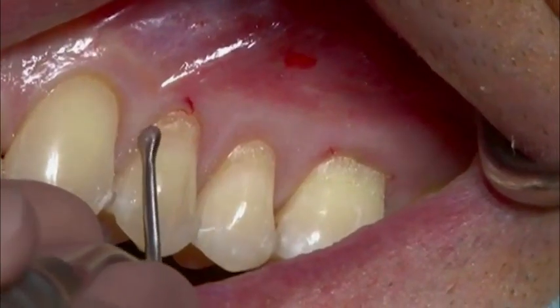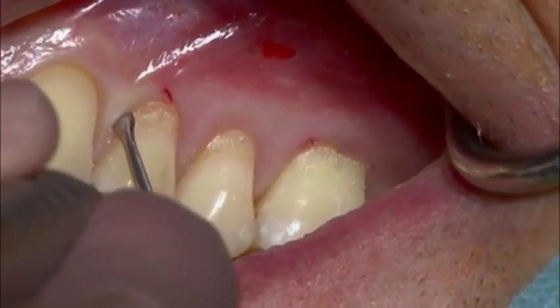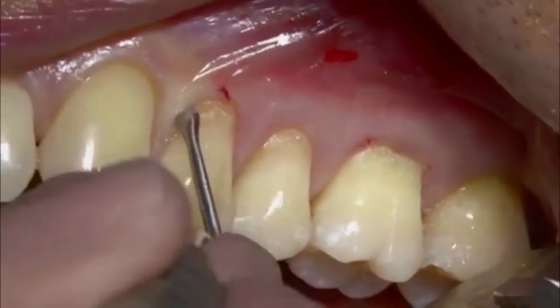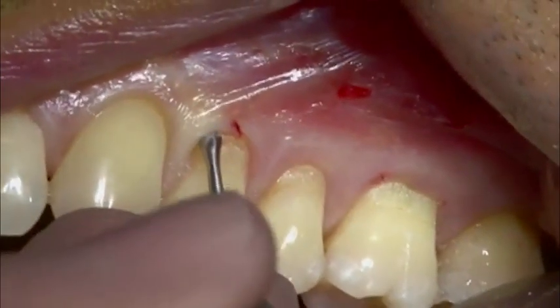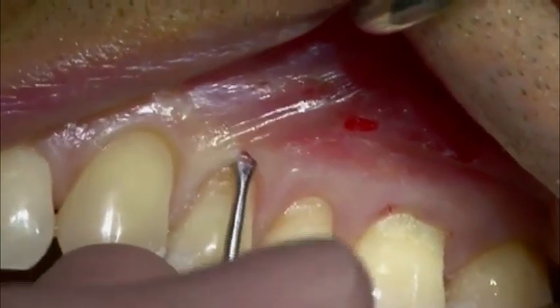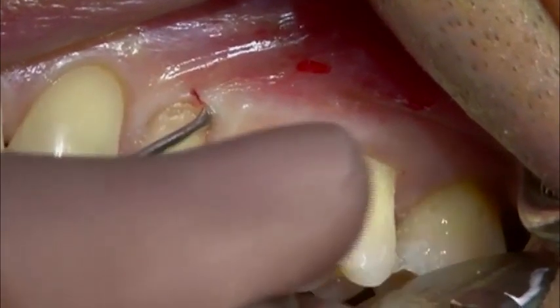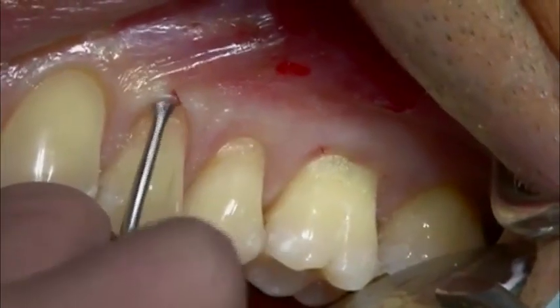The intrasulcular incision is made with a curved tunneling knife. The instrument is kept continuously in contact with the bony surface to avoid the risk of soft tissue perforation. The mucoperiosteal pouch is elevated just past the mucogingival junction.